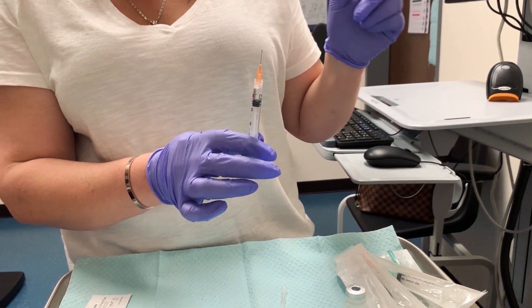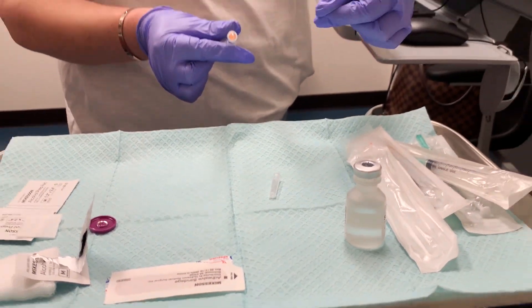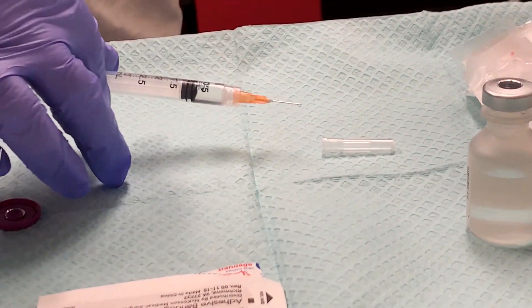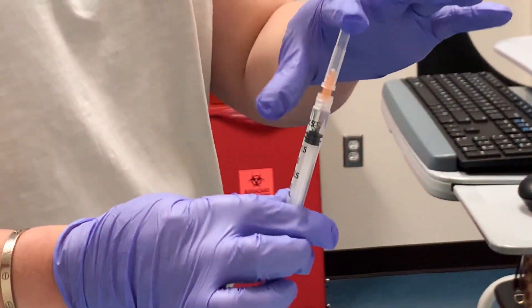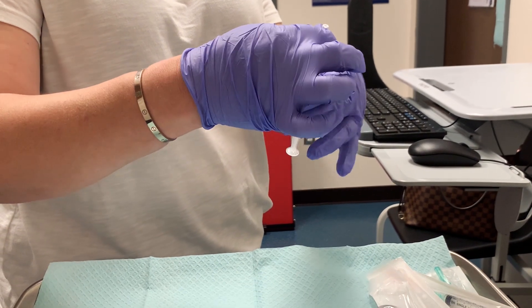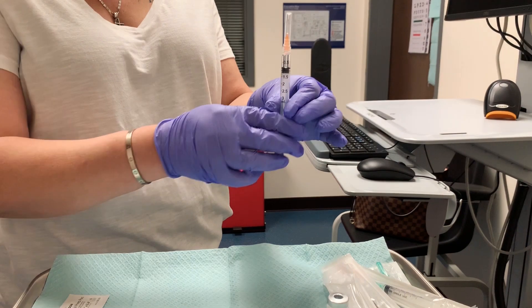This is the only time it's ever safe to recap a needle — and only because I know this needle is clean. To safely recap it, never pick the cap up and try to stick it back on. Instead, place the cap on the table, push the needle into it with a scooping motion, pick it up, then press it down and click it. I like to twist it to make sure it's good and tight so the needle doesn't go flying when I flick out the bubbles.